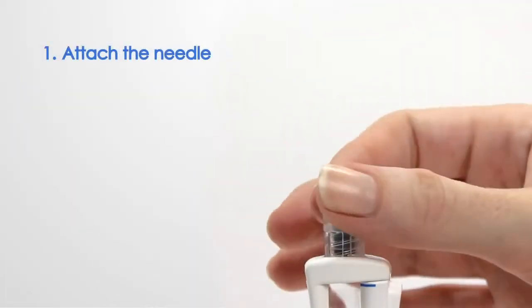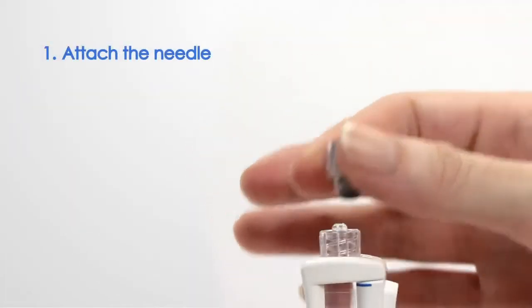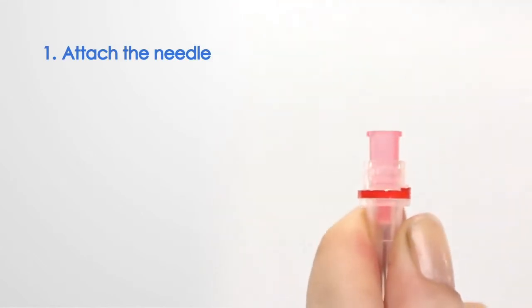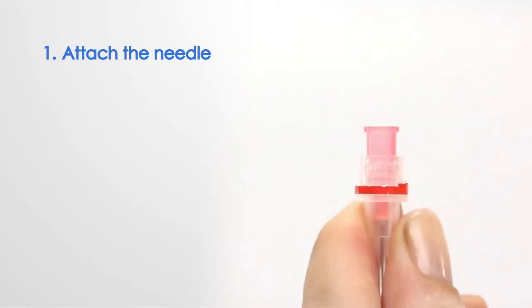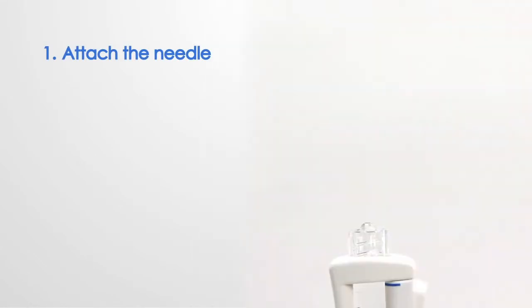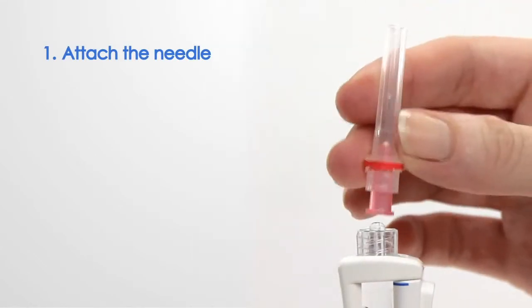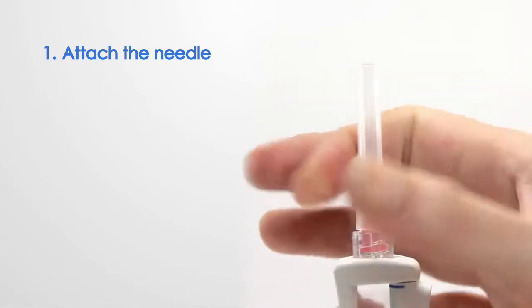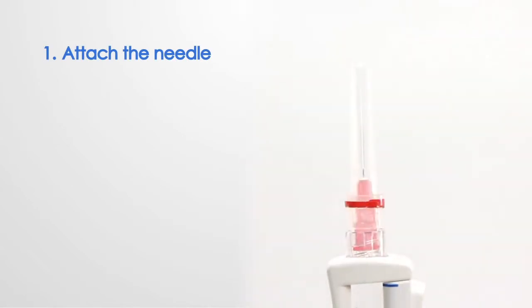Unscrew the protective cap from the syringe, as well as the rear cap of the disposable needle. Screw the needle onto the device in a clockwise direction.